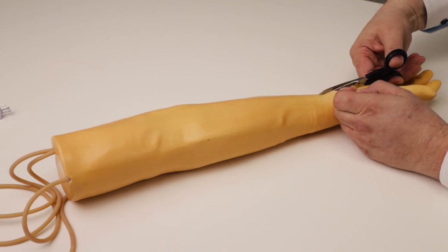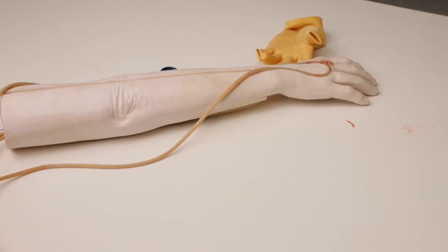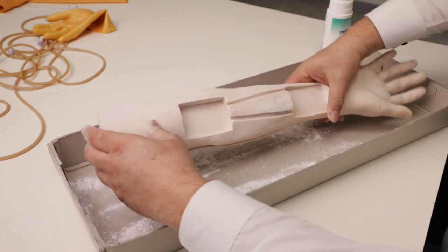If you need to replace the skin, simply cut it off and also remove the veins. After cleaning the arm, carefully cover the arm and the inner side of the skin with plenty of talcum or baby powder.